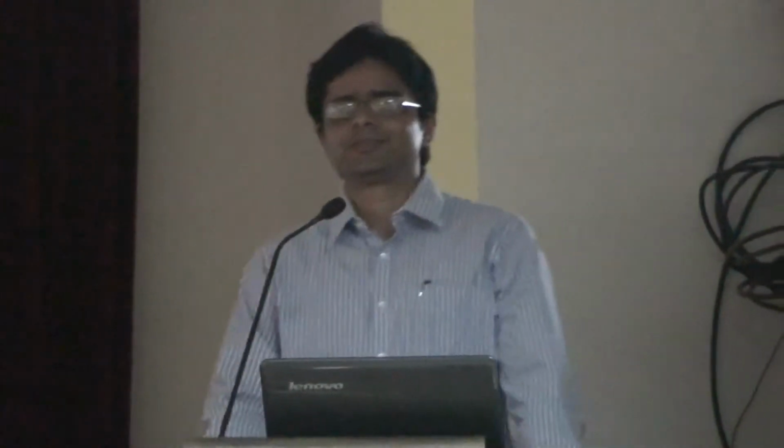Thank you. So this NIV is usually positive pressure ventilation. Yes. But there is one NIV that is called negative pressure ventilation, the iron lung. It is still in vogue. In 1876, the first model, Graham Bell himself produced this ventilator. It was a big box-like machine, with the patient's body inside the box and the head outside. That is called iron lung.